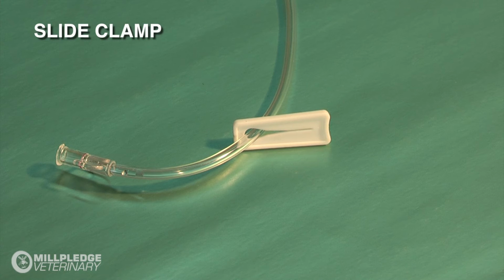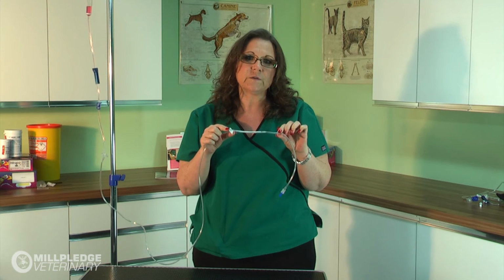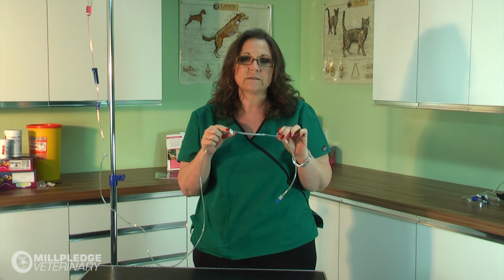leaving the distal end connected to the indwelling cannula, allowing you to walk your patient without having to take the fluid bag with you. The slide clamp allows the distal end of the tube to remain primed with fluid if the break point is being used and you are going to move your patient.